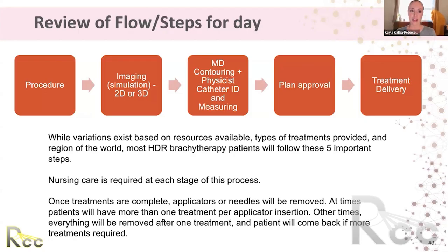The role of nursing varies a lot, but the most important thing is with gynecologic brachytherapy implant removal, there's a chance for bleeding. The nurses will assist the physicians or whoever is removing it, but we have to be ready for bleeding, vaginal packing. Hemostatic matrices can be really helpful as well if they're available to help topically stop bleeding, but we have to have everything ready and have sets of hands in case there is an advanced bleed happening.